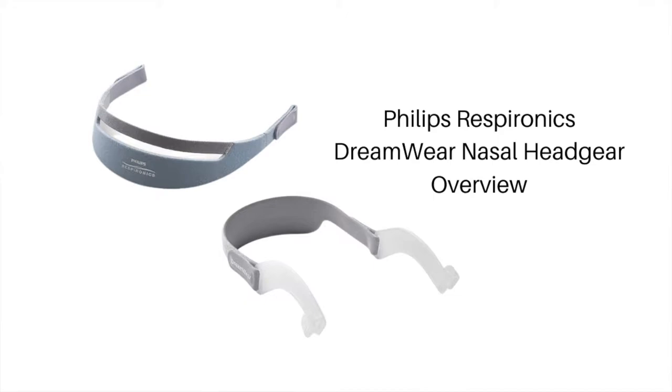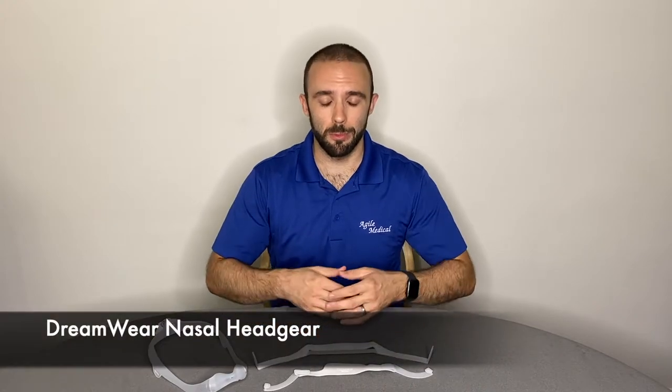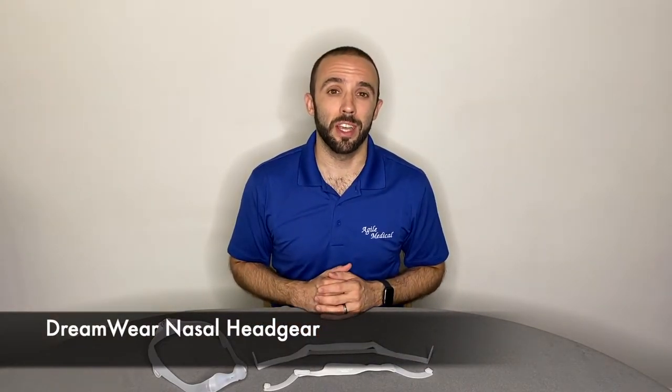Hi, I'm Andrew from The CPAP Shop. The Philips Respironics Dreamwear headgear for the nasal and nasal pillows mask is a one-size-fits-all design. This soft, comfortable fabric allows users to sleep soundly and securely all night long.